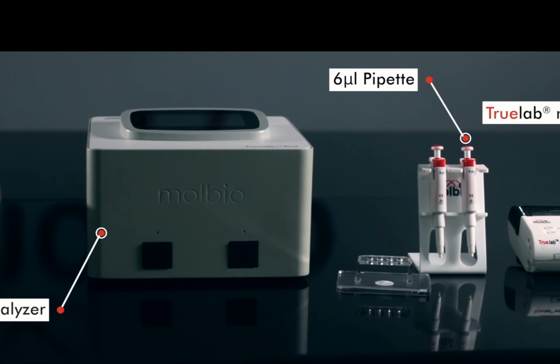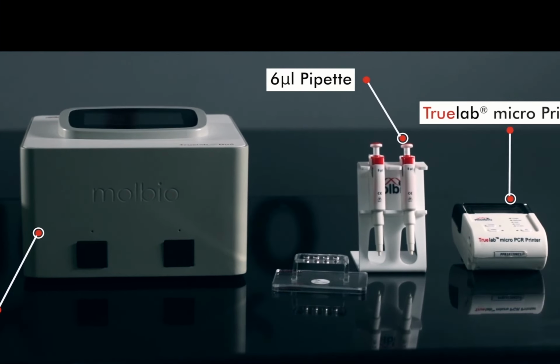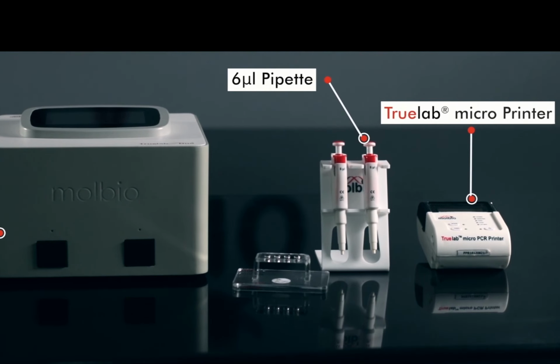Then we have this 6 microliter precision pipette and the pipette stand. Next to it you can see the PCR tube stand. Then to print the results, we have this TrueLab micro printer, a Bluetooth printer. So this can be used to print the particular result. These are the three machines which are used in a TrueNat workstation.